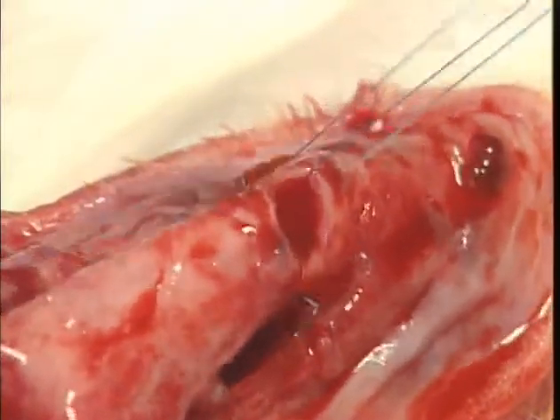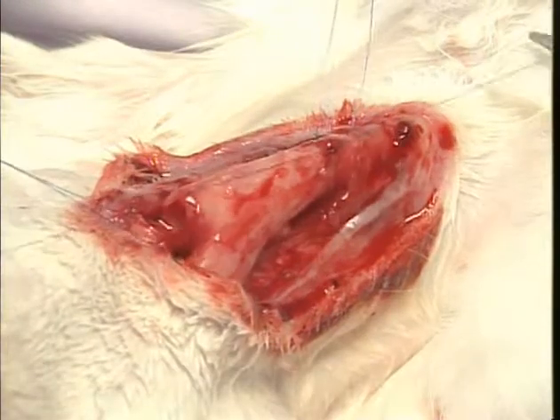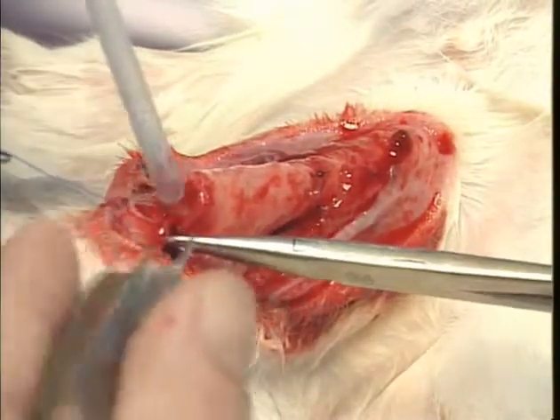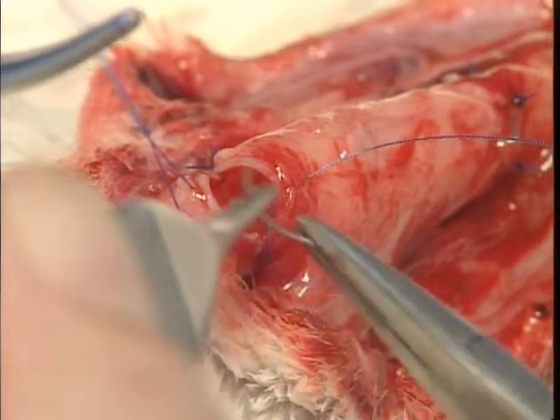The upper anastomosis is completed with different sutures tied with the knots lying on the outside. The lower anastomosis can now be completed. The rabbit breathes spontaneously during the whole procedure.